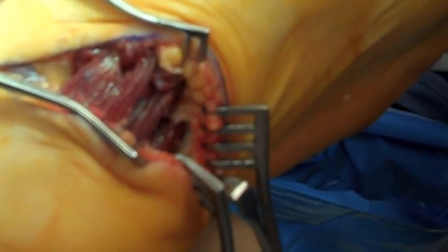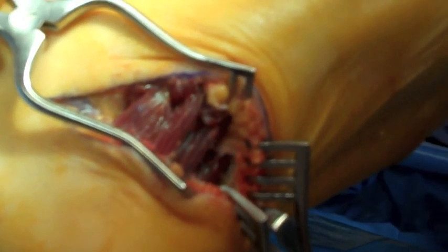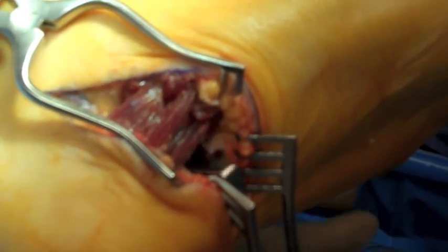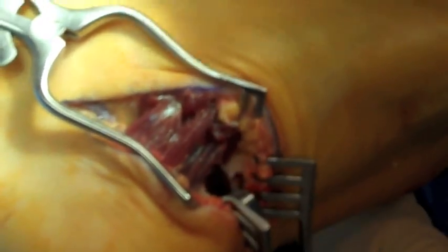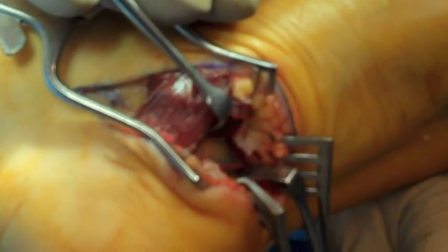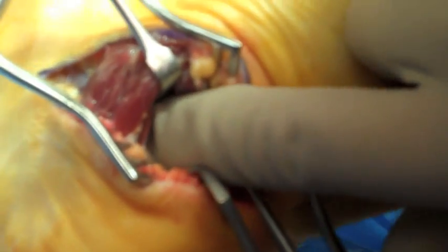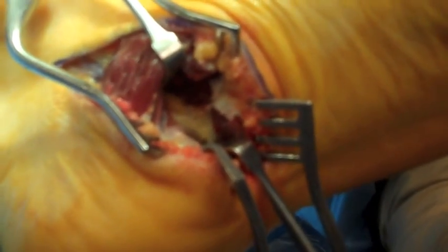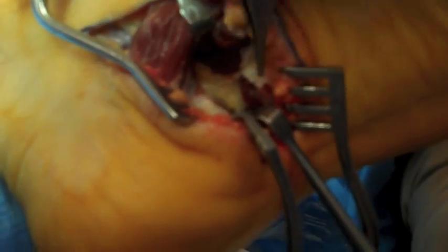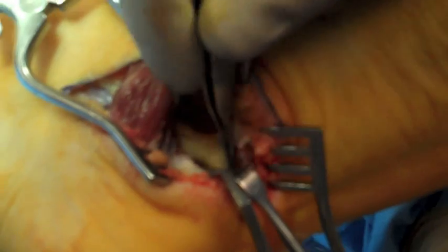Once this is complete, the abductor hallucis muscle belly can be retracted dorsally and the flexor digitorum brevis muscle belly is retracted laterally to expose the course of the neurovascular structures, including Baxter's nerve. Typically it will be lying within the fibro fatty tissue that is visible between the two syn retractors. The nerve is being identified with a pair of pickups.